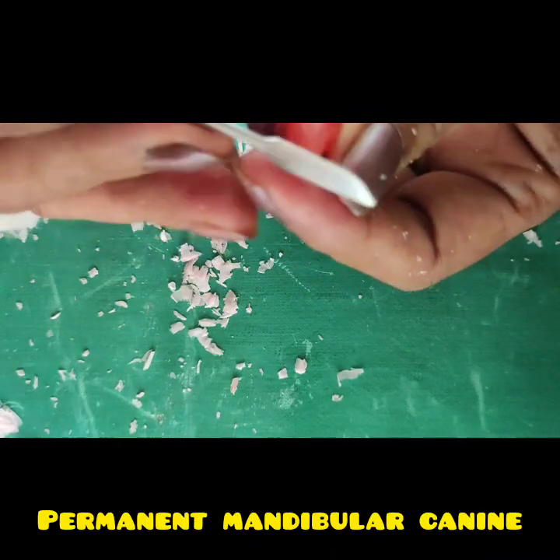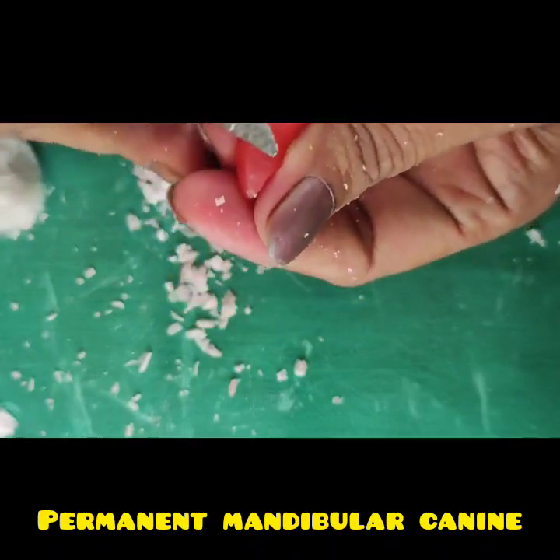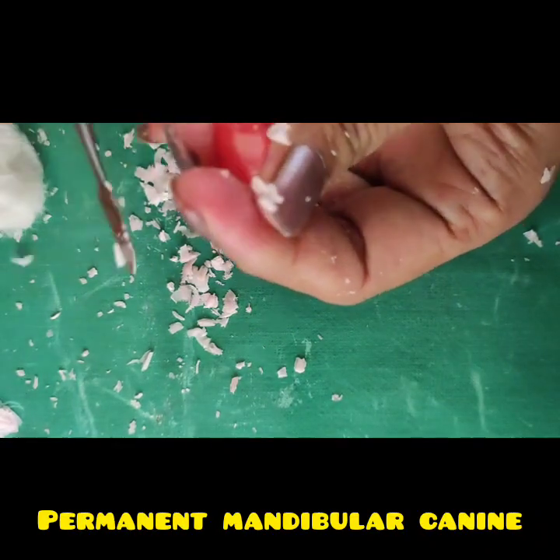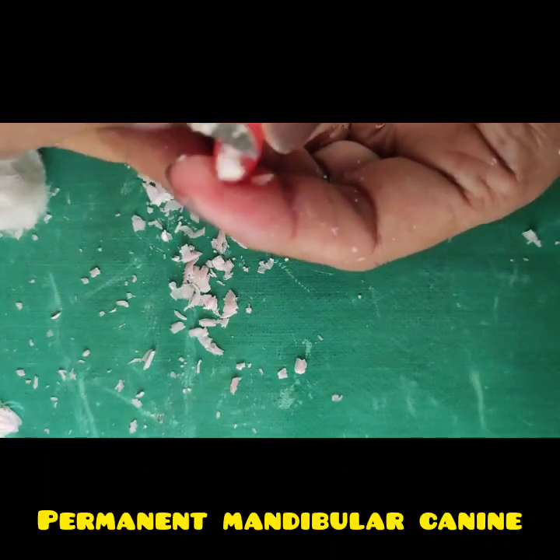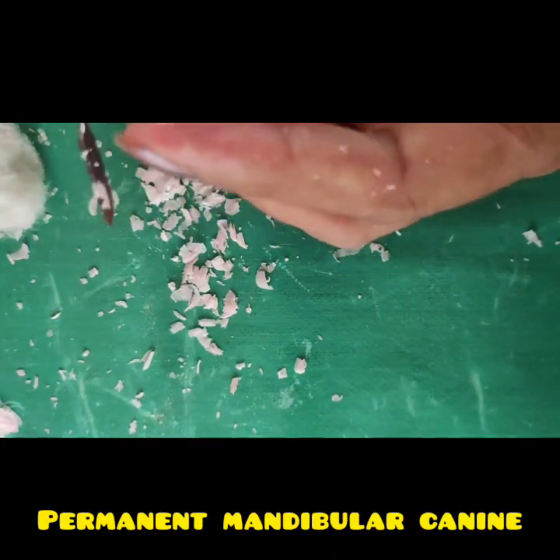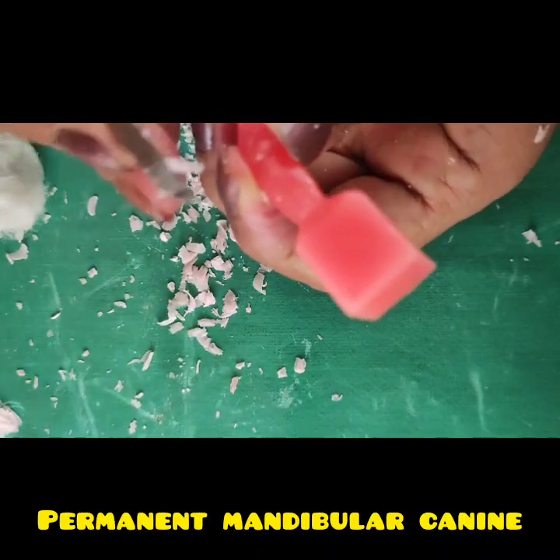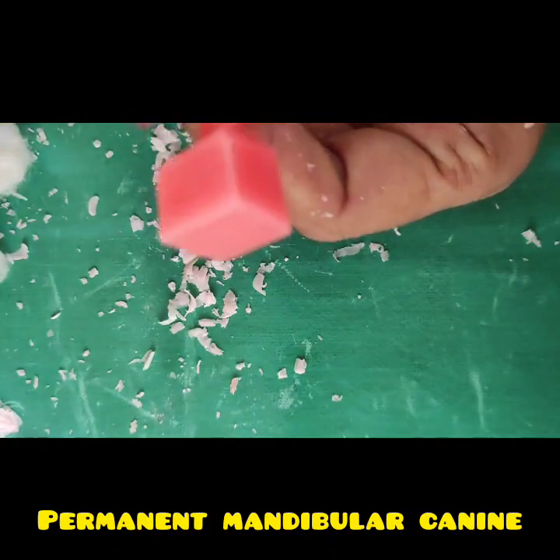wider, so I will reduce proximally, because mandibular canines roughly match the mandibular incisor dimension, so they look thinner and elongated, not like the flared maxillary canine.